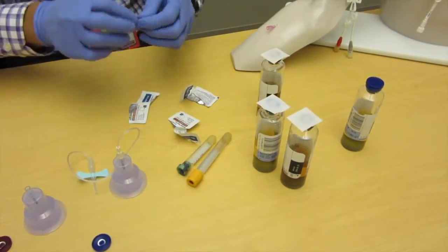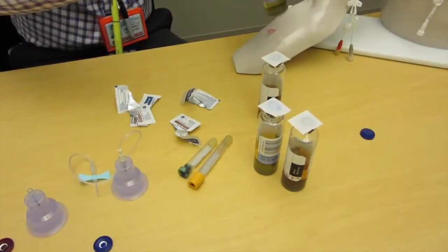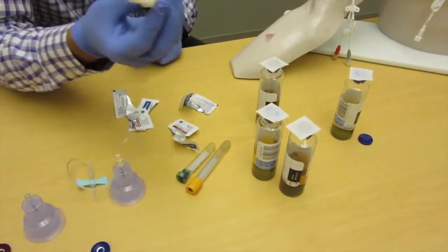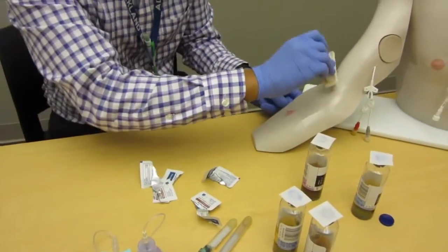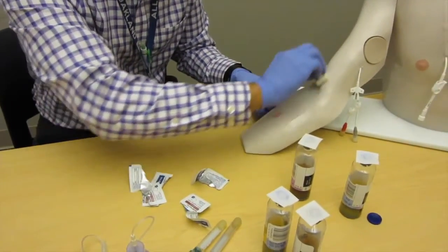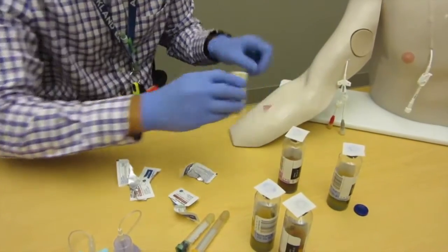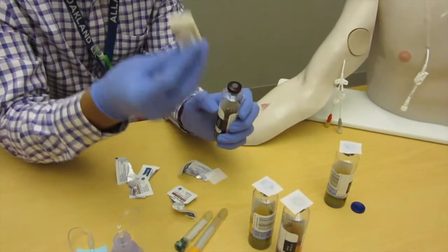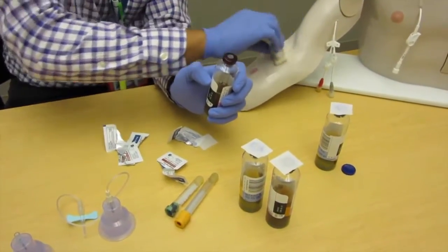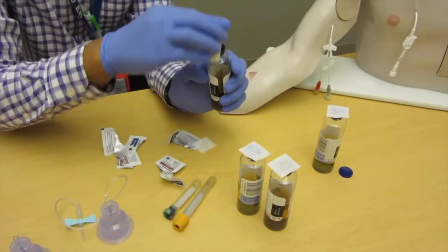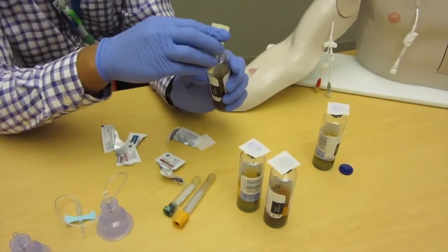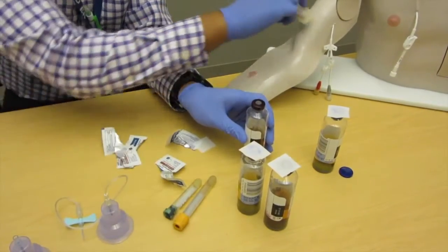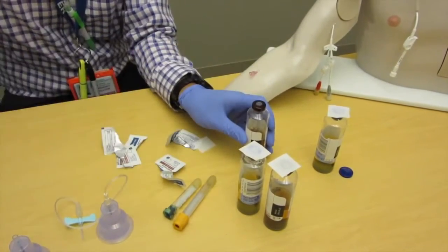One other mistake that can happen is this: some people, after they scrub for 30 seconds, take the same chloroprep they scrubbed with and start scrubbing the top. What did you just do? You just took the skin cells and you scrubbed them off this arm and put them right on top of the bottle. Please make sure you do not do that. Do not use the same chloroprep scrub that you use on the arm to scrub the top of your culture bottles.